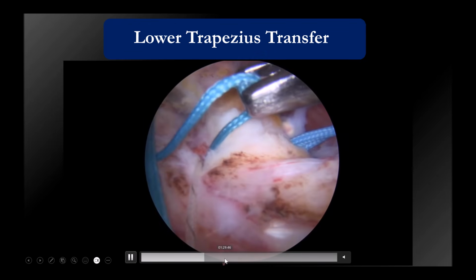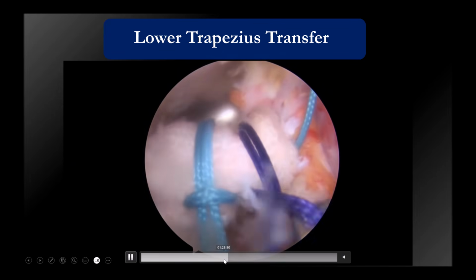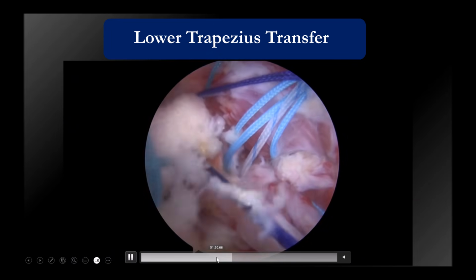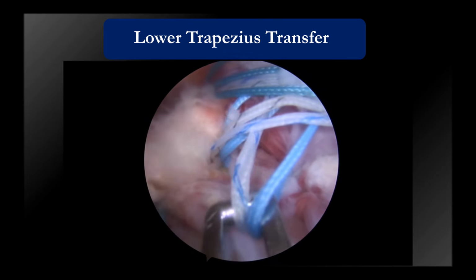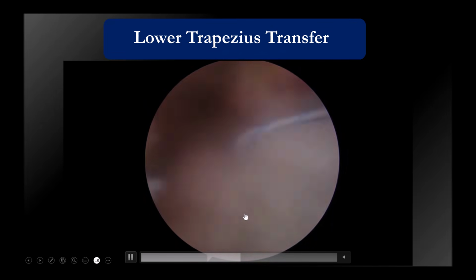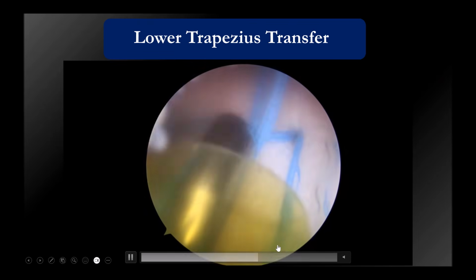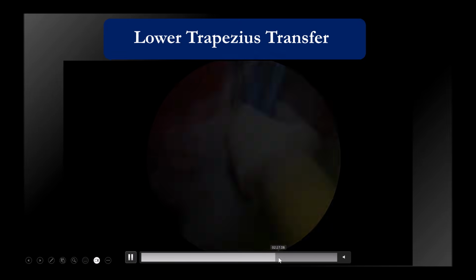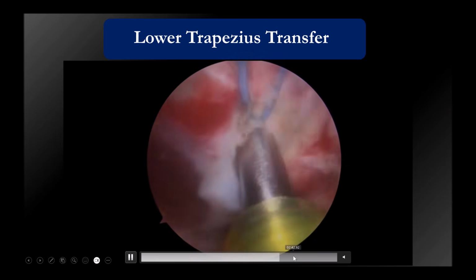So that is the graft. I use the mechanical augmentation because I can use this patch to augment your repair, to make a better mechanical and biologic augmentation. Then you repair this to your supraspinatus, like this. Make a suture bridge technique.